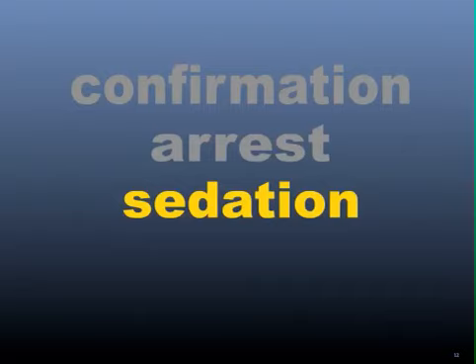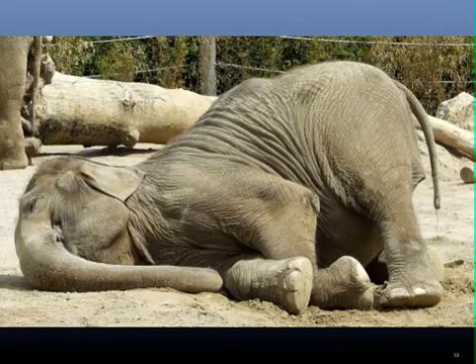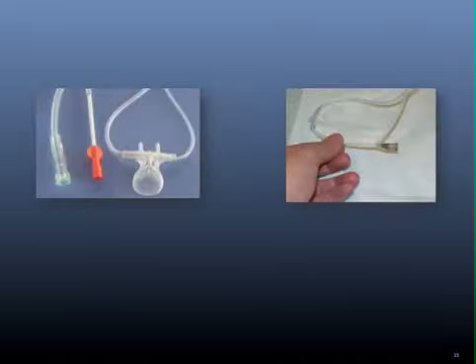Third, we can use end-tidal to monitor sedation. It's the easiest way to make sure that you know when your sedated patient stops breathing. It's great for monitoring any type of sedation, procedural sedation, pharmacologic restraint, or even patient-initiated sedation, which I imagine some of you see in your ED from time to time.